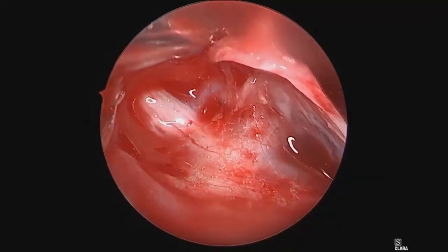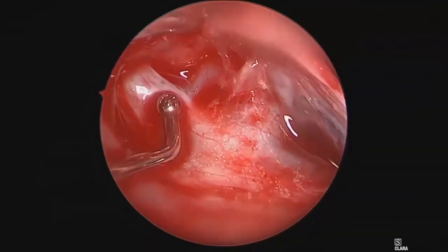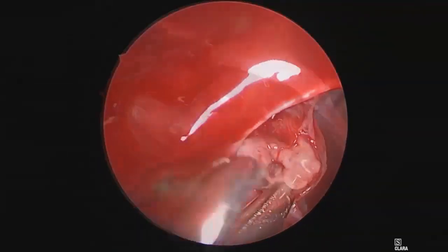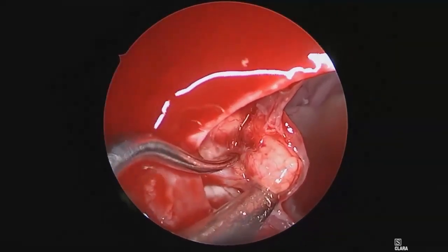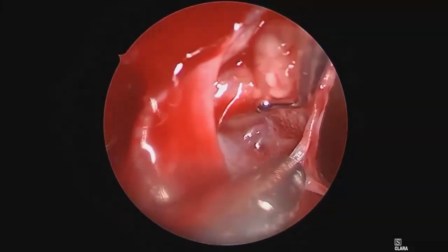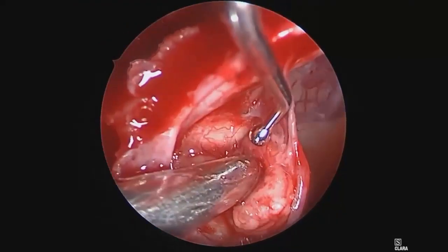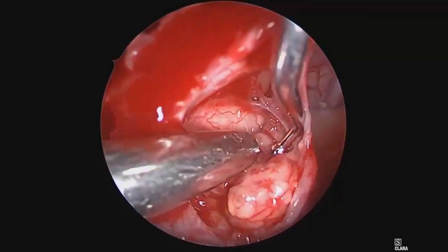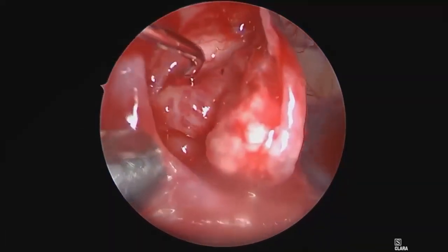Dissection planes are methodically developed. As you can see here, a ball probe instrument is used to develop these planes in a blunt fashion. Here we use a microdissector to carefully peel off this residual of dermoid that's attached to the medial aspect of the optic nerve. Here we see the peeling of the dermoid away from the medial aspect of the optic nerve with minimal to no stretch on the optic nerve itself.